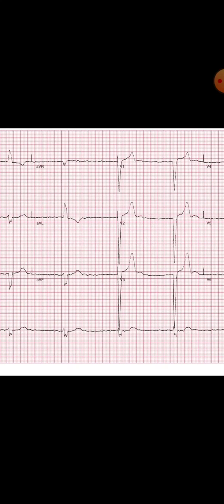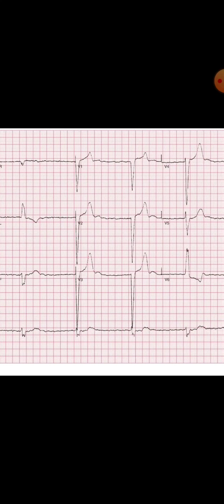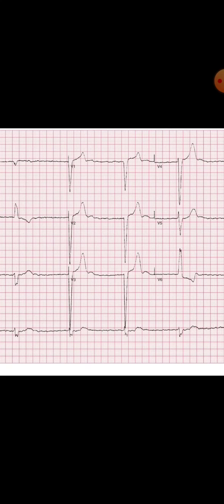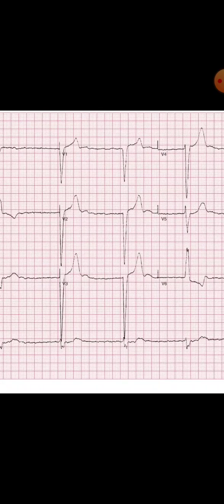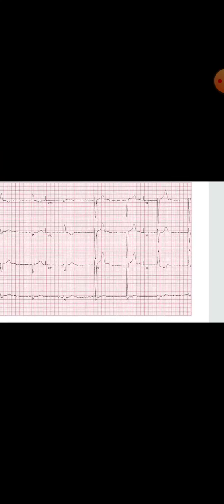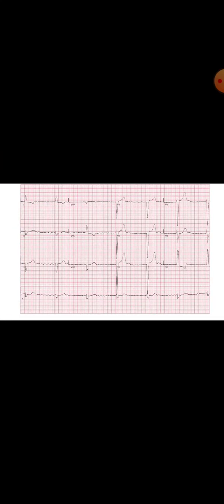Since the QRS complexes are wide, this indicates the escape pacemaker is located in the lower portion of the His-Purkinje system. As additional information, in complete heart block if the QRS complexes are narrow, it means the escape pacemaker is located in the upper portion of the His-Purkinje system. That was all about today's ECG — thank you very much.